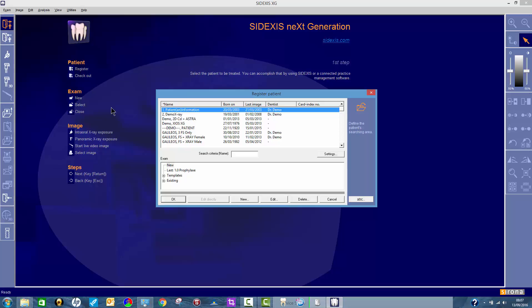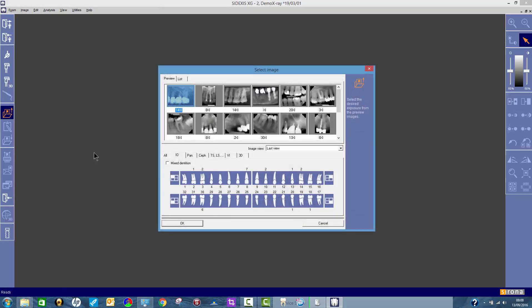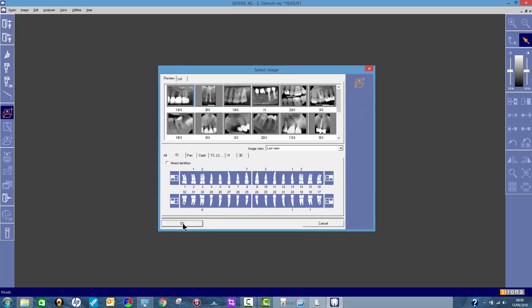So first of all, find your wrong image. So I'm going to go to this patient and find an image. So just say, for example, that this image here I've put it in the wrong patient and I want to move it. So open the image first, there it is.